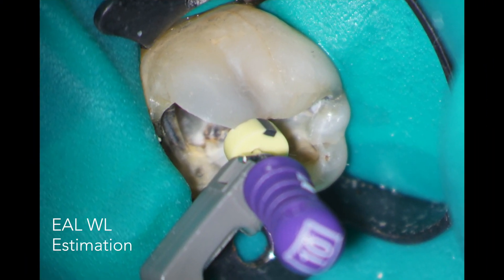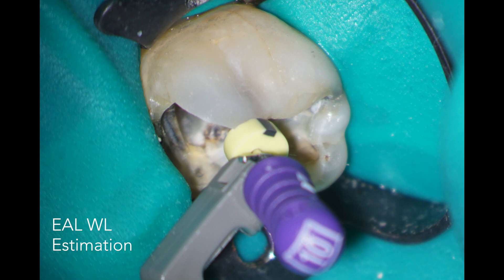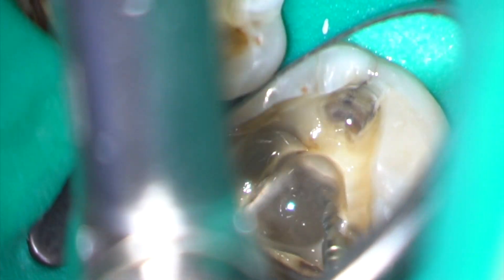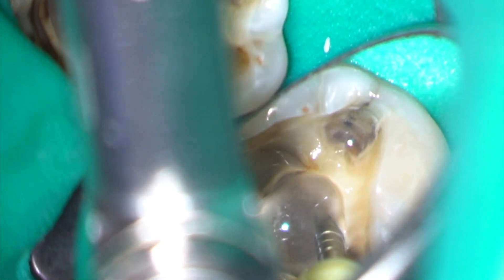At this point I got my first estimation of working length. I later exposed a diagnostic working length radiograph, as you'll see. There were four canals, all prepared using nickel-titanium reciprocating instrumentation — Wave One Gold and Edge files. Copious amounts of 3% sodium hypochlorite were used to irrigate, and patency filing with a size 10 flexor file between instruments.